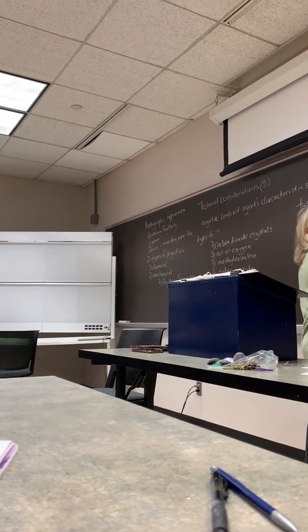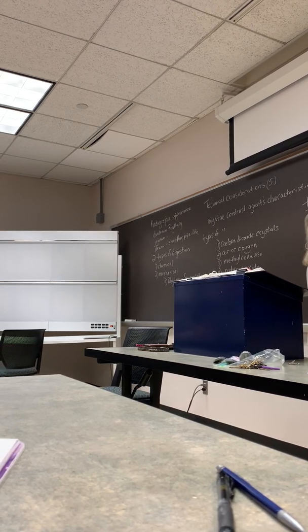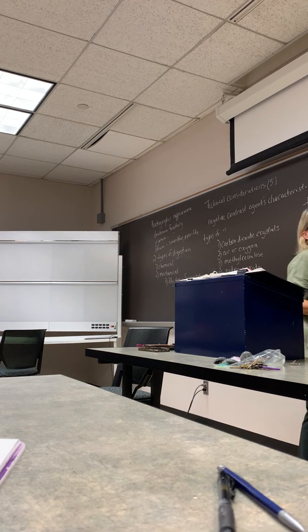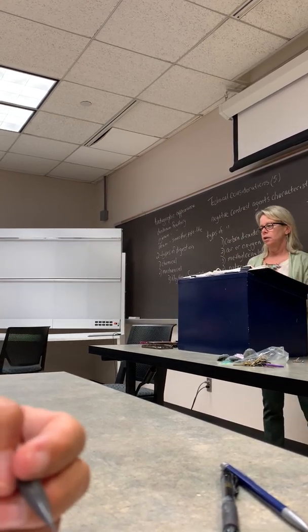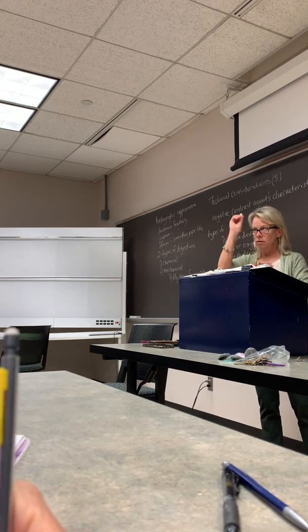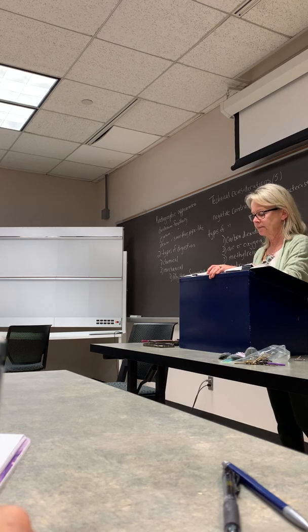So the lumen is very swollen. The radiographic sign for Crohn's disease, they call it the string sign, because it just looks like a string. You don't see the lumen, you just see a little string. So it's known as the string sign.